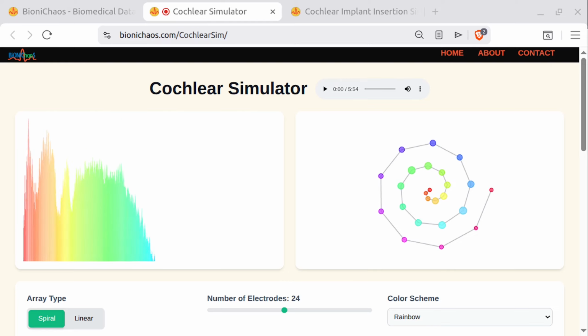Well, imagine your eyesight being tied to a Wi-Fi connection. You're having a deep emotional conversation with your spouse, or you're walking through a busy intersection and suddenly the router resets. That's a bit dramatic. Is it? You are plunged into total, instantaneous darkness. That's exactly what a dead battery feels like to a cochlear implant user. It is an interruption, yes, but it takes 10 seconds to swap a battery.